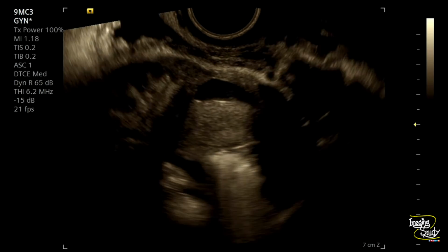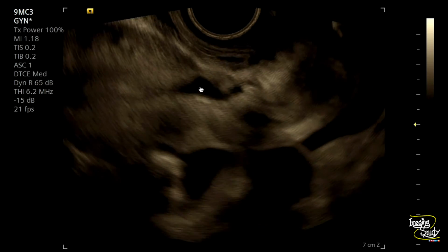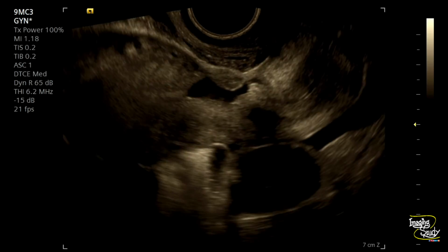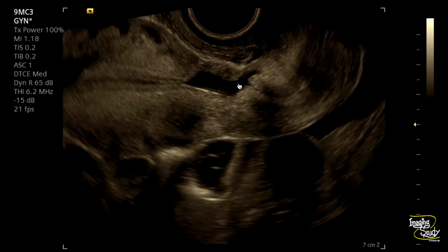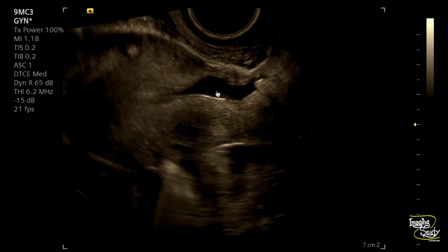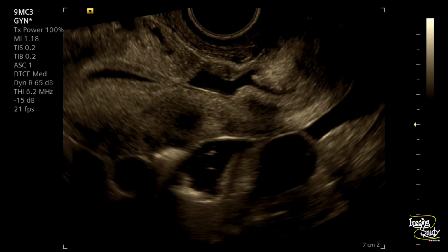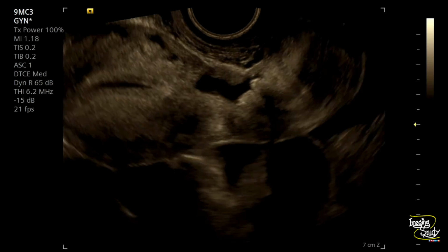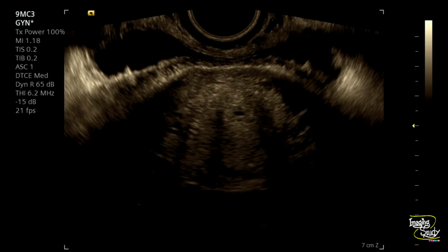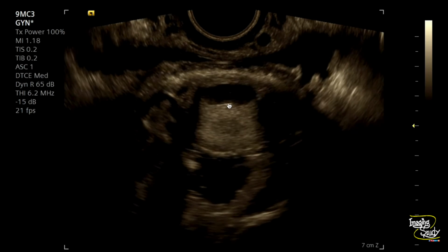Let's check again on real time. This is the longitudinal section of the uterus containing 2 semilunar and triangular areas of collection. If you check carefully, the fluid here is not completely anechoic. Rather, it contains some hypoechoic material inside. Here's the transverse section. You can see the collection here at the narrowing parts.